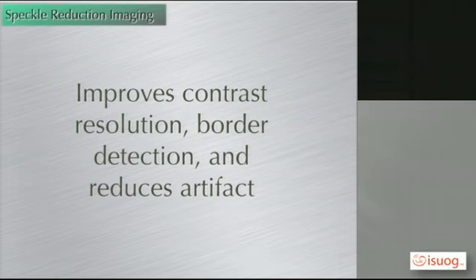Let's examine speckle reduction, or SRI. A third option is speckle reduction imaging, or SRI, which improves contrast resolution, border detection, and reduces artifact. This can be activated either before or after image acquisition occurs.